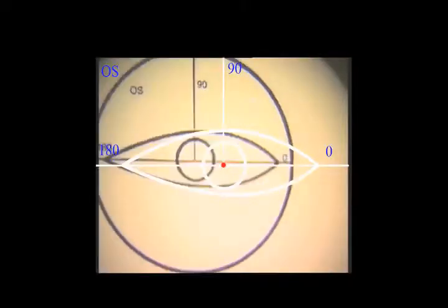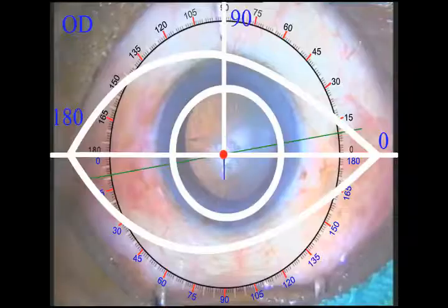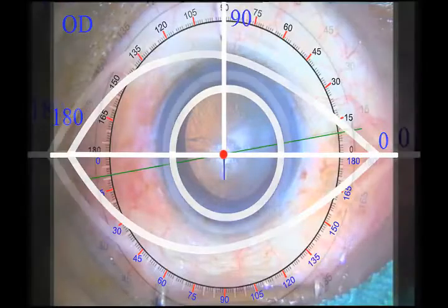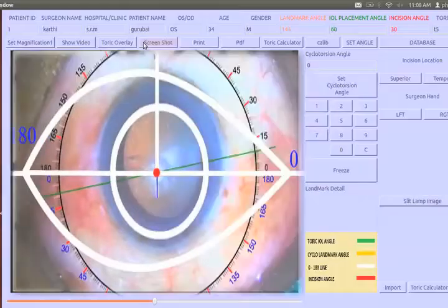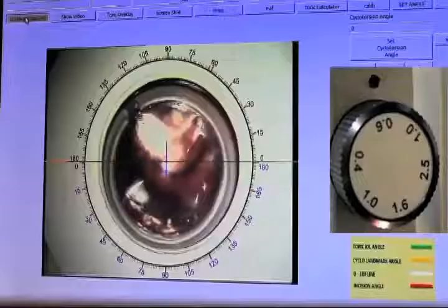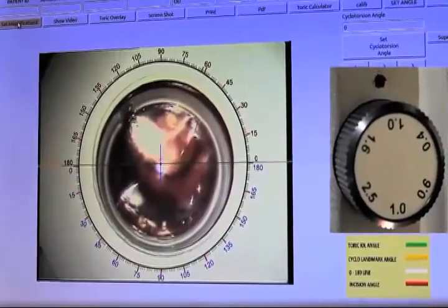This is to obtain the exact reference angles of the operating eye to match the scale marking in the software as a reference axis from canthus to canthus point in the capture window of the software, corresponding to the circular scale angle as indicated. The working magnification of the surgeon during the surgery is also set.